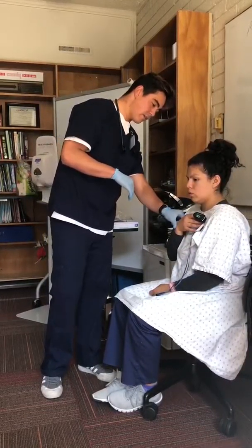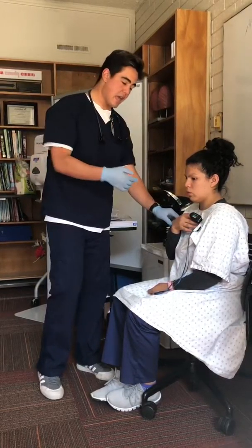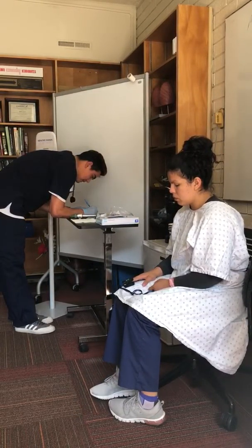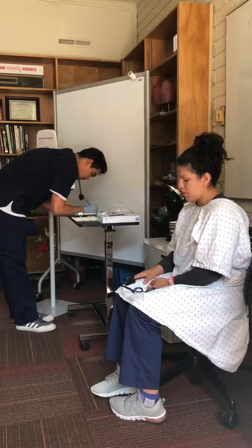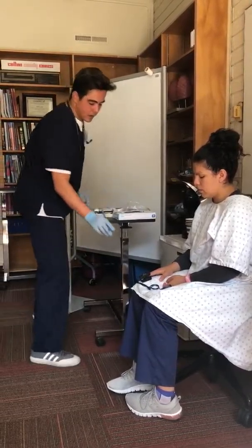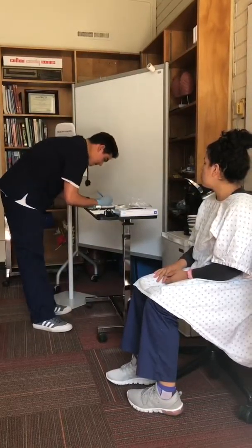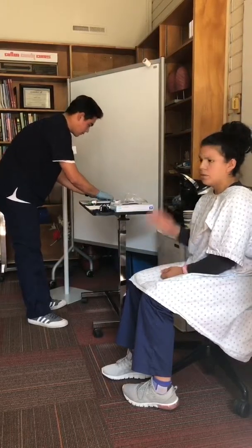Alrighty, so we're going to have a pulse of 30 and a respiration rate of 10. Thank you. I'm going to leave that on for just a second. So we're going to multiply that by 2. So our heart rate is 60 beats per minute and 20 respirations per minute. I'm going to go ahead and check. She is sitting at 98% right now. 98%. I'm going to record all our data.